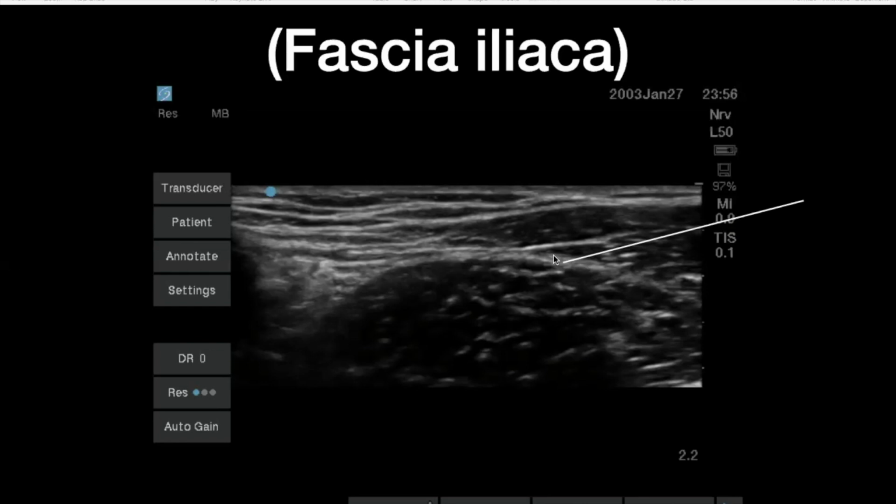So their argument is actually, if you can see a big juicy nerve here, that's the femoral nerve, that's going to give you a decent proportion of analgesia for the hip joint. Why not block that nerve properly and get a good, reliable femoral nerve block, rather than putting lots of local over here and hoping that you get spread over here, as well as this possible proximal spread to the other branches, which probably won't happen.